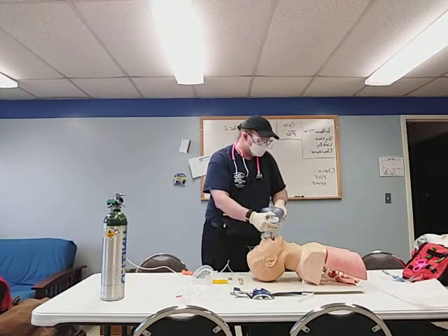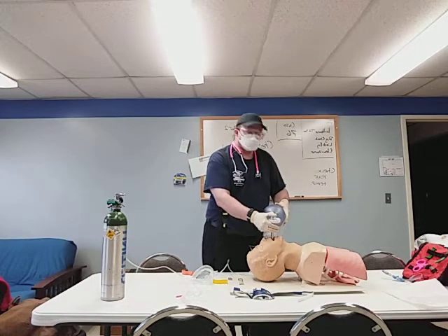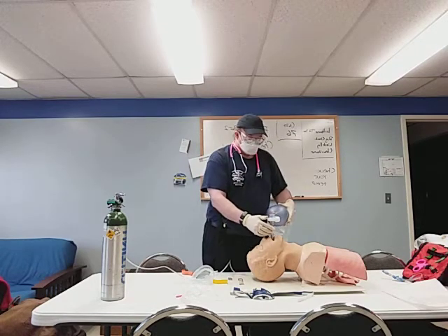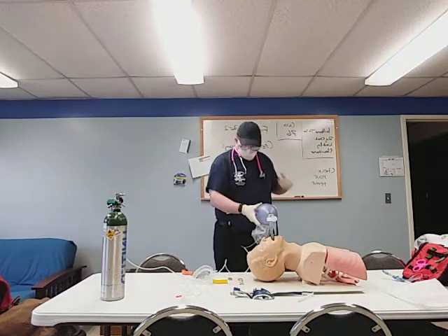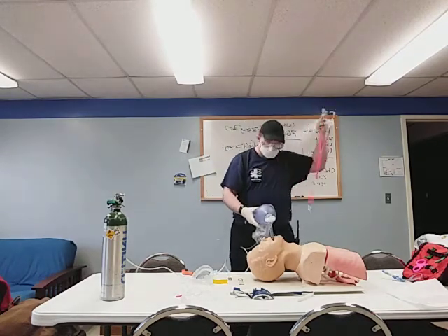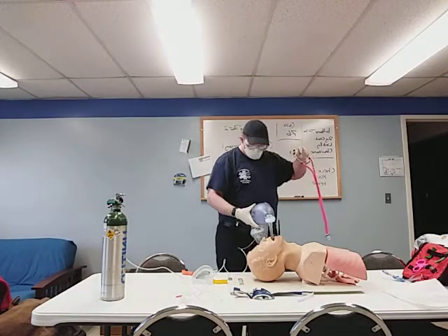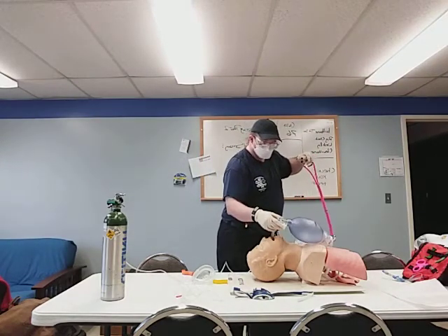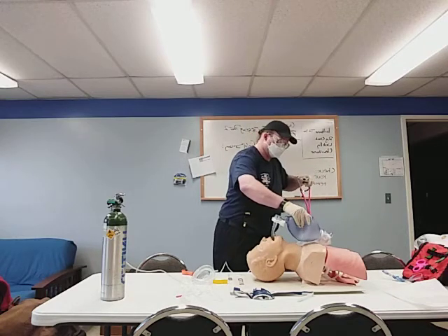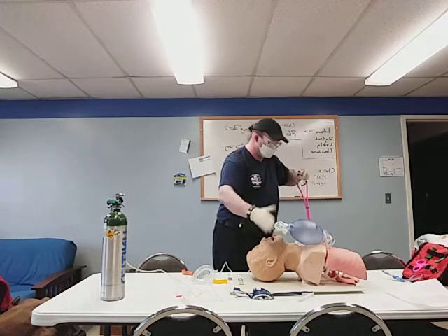And I have good placement. I don't need to adjust it as far as I can tell, because I'm going to be careful not to dislodge or move the tube.